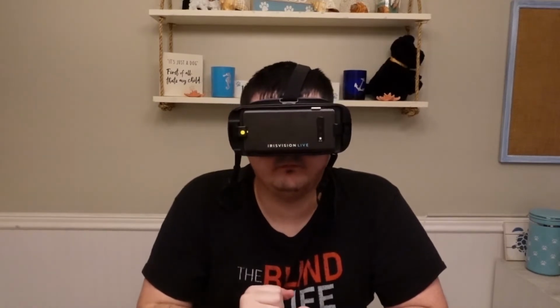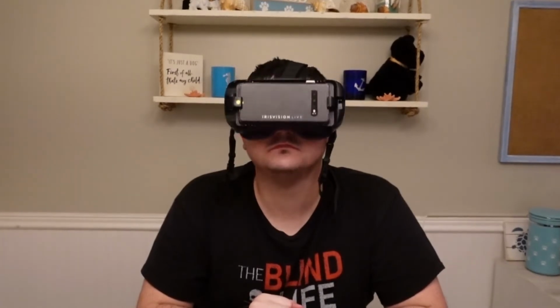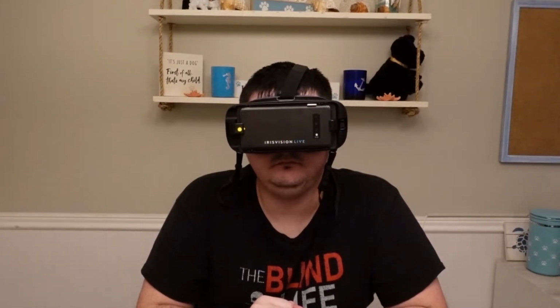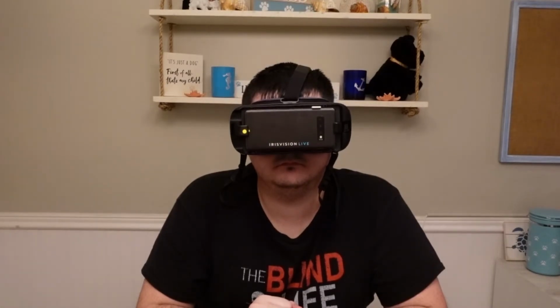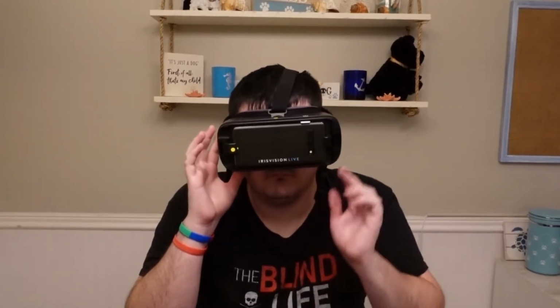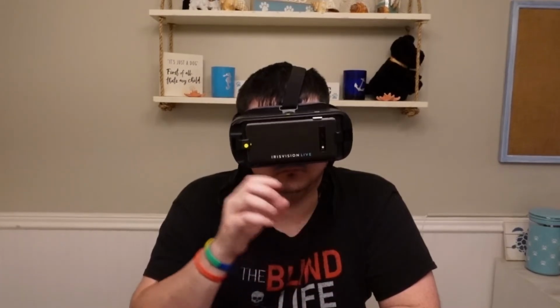And then pan within the photo by moving your head left, right, up, and down to capture the entire photo. To reset the photo to the center, use the voice command reset photo. To exit the photo in full screen view, press the mode button once. And to delete a photo, first select it from the gallery. When it is displayed full screen, press on the touchpad for 3 seconds, which I'm guessing is hold, to activate the delete prompt. Swipe up to delete the photo and swipe down to return to gallery.